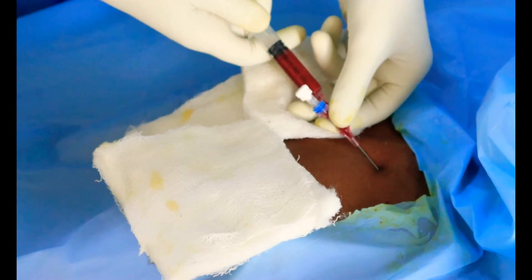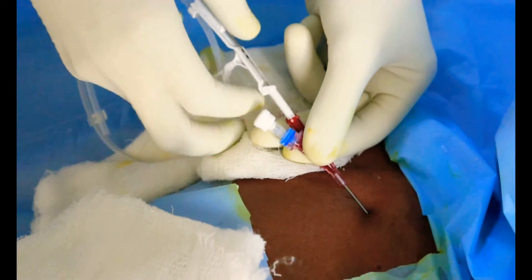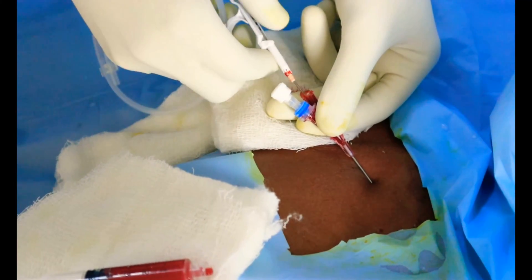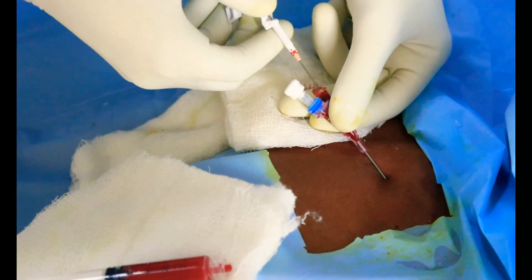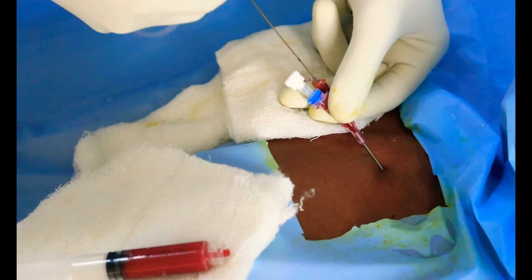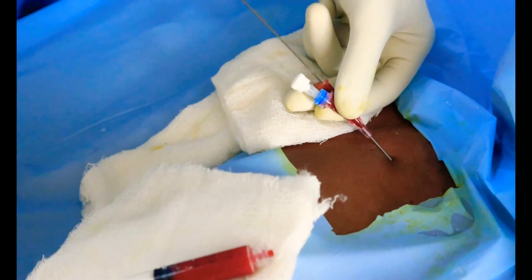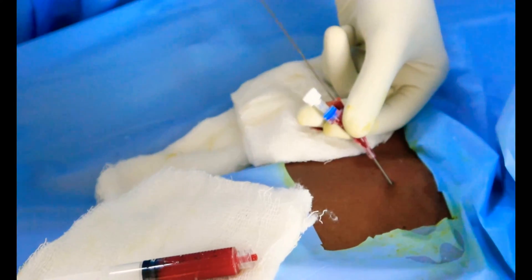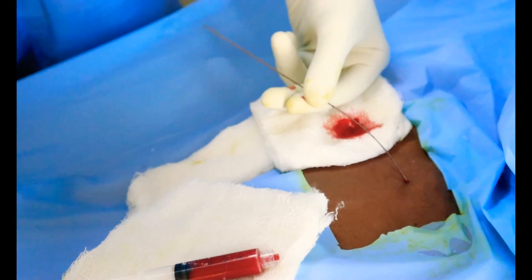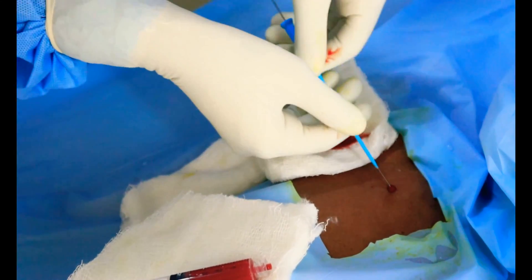Now securely hold the needle, remove the syringe, and insert the guide wire. The guide wire should be advanced with little resistance. Always maintain control of the guide wire. While holding the guide wire, remove the introducer needle. Once the introducer needle is outside the patient's skin, hold the guide wire at the entry site and slide the needle off the guide wire.